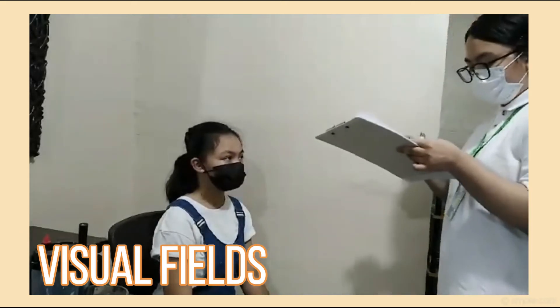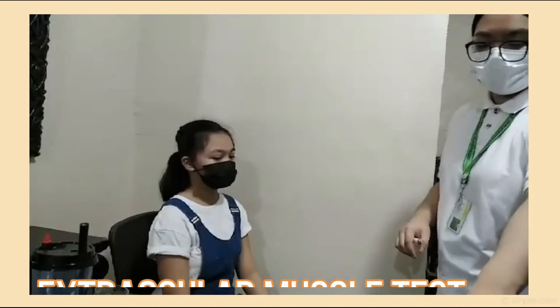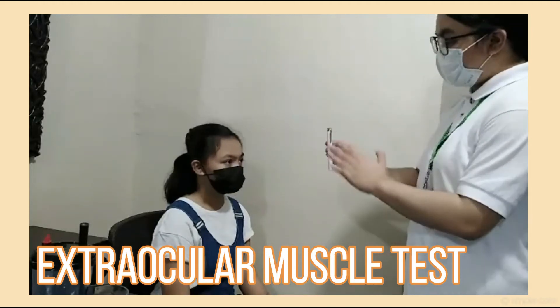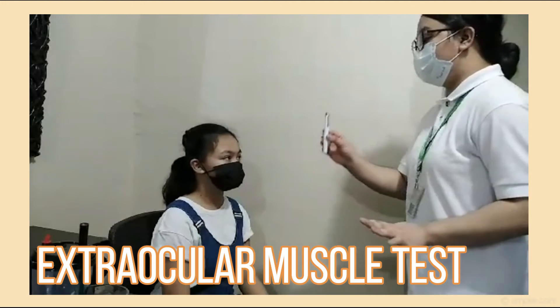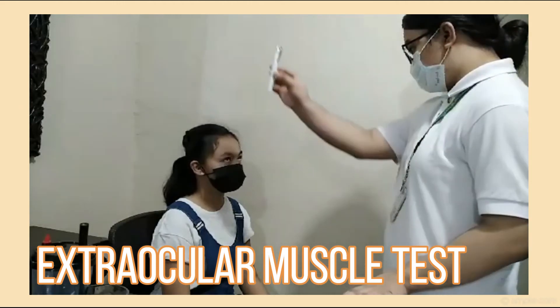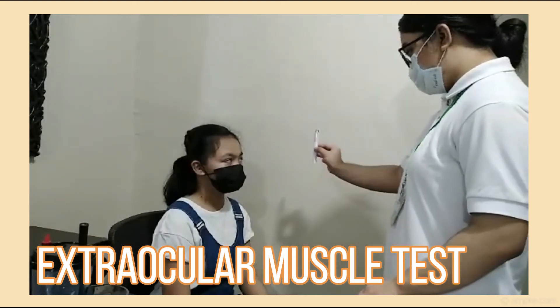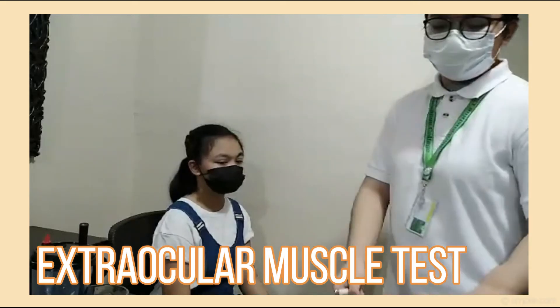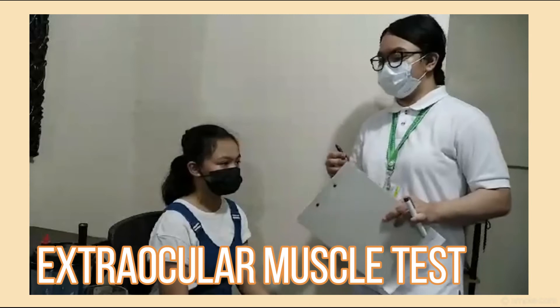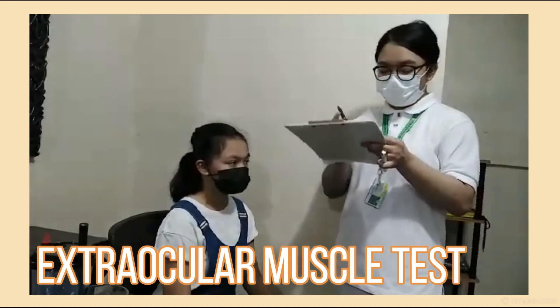Next, we assess the six ocular muscles — the eye movements — to determine eye alignment and coordination. I'll ask you to move your eyes following where the pen light goes. I see no twitching, no poor coordination; the eyes moved together with the pen light. No abnormalities in that area.